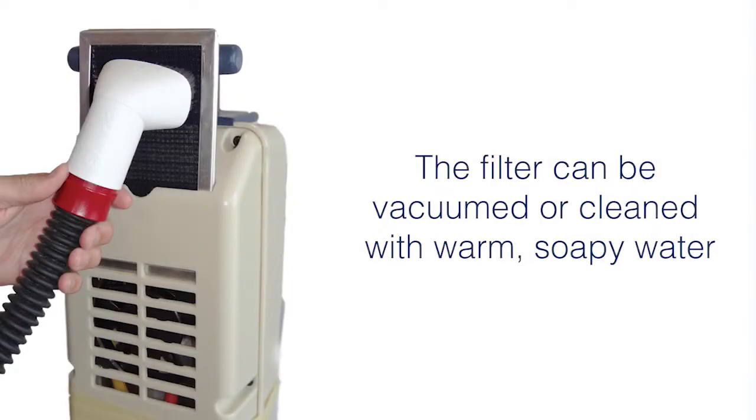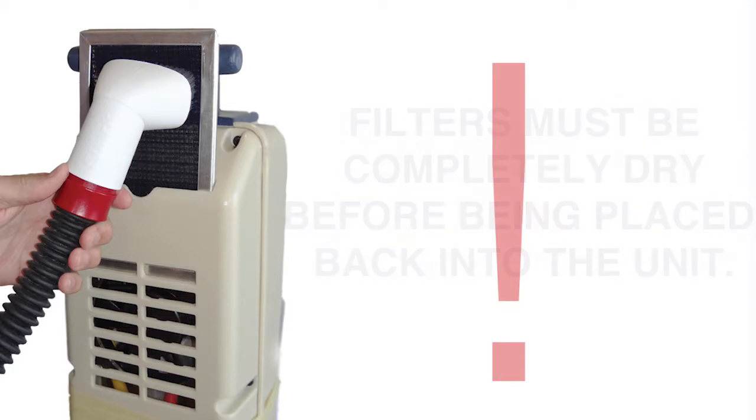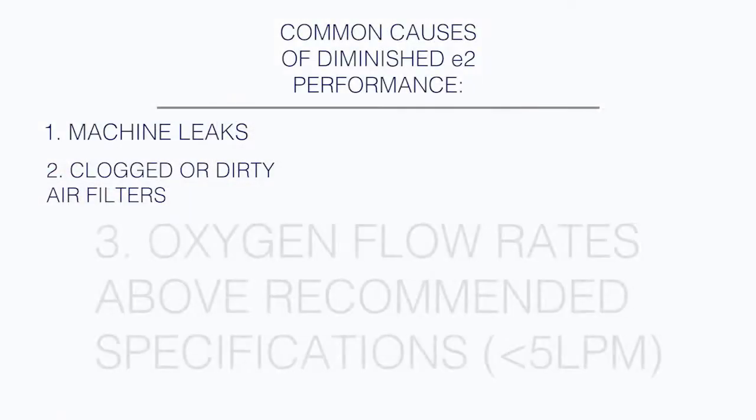The filter can be vacuumed or cleaned with warm, soapy water. Filters must be completely dry before being placed back into the unit. Any amount of water left on the filter can ruin the internal sieve material.